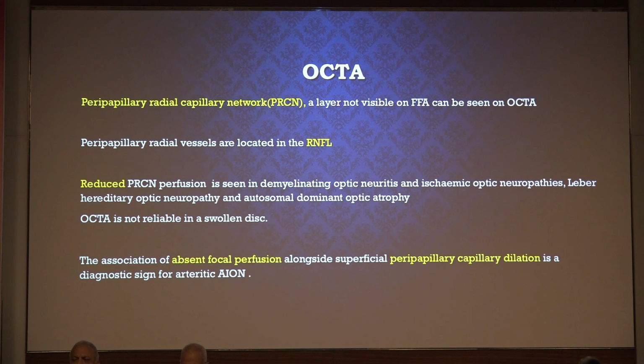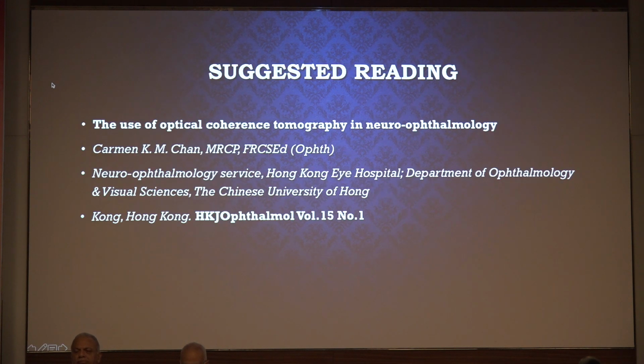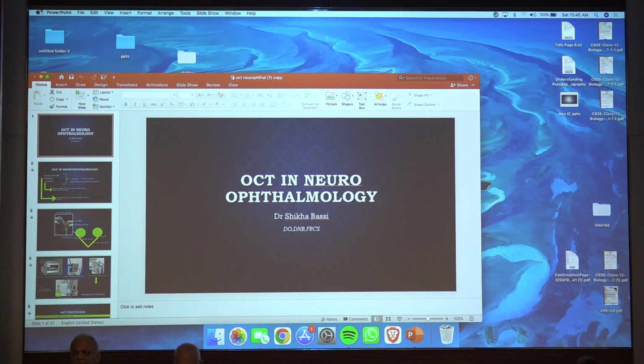OCT, I'm not going into it, but one important thing is that this layer, the peripapillary radial capillary network, is not visible on FFA, but is visible on OCT. Thank you. Thank you, Shikha.